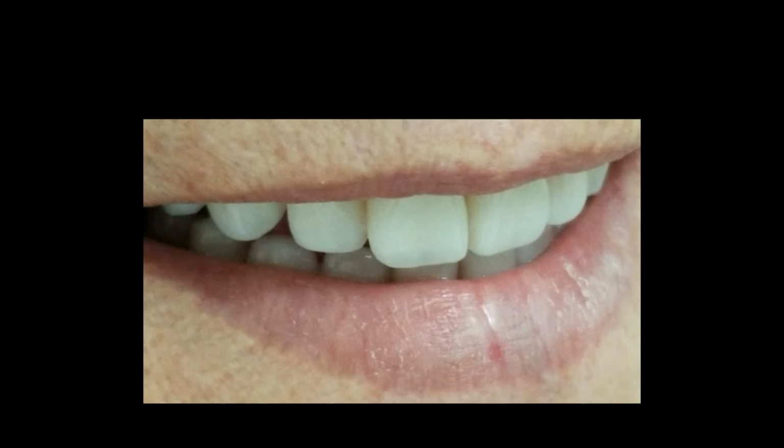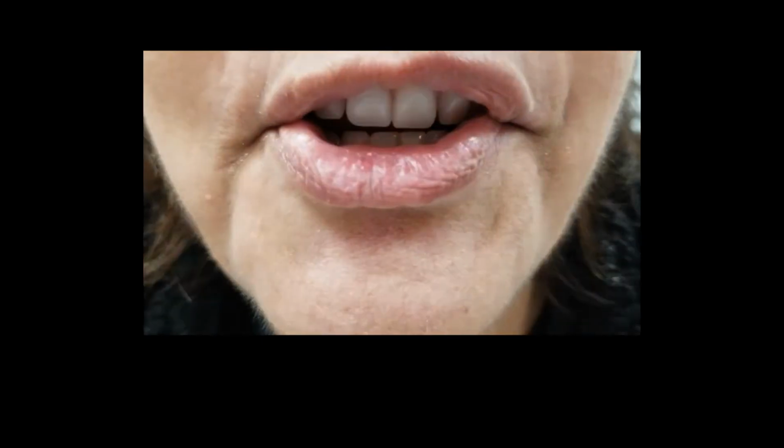So now I'm learning to identify a chew cycle of a patient. And even if you're a dental technician, this is something that you can take to your doctor, especially on the next stressful trouble case that you have come in and everyone's a little tense on it. You can say, look, I need you to take a video for me, and then we can have that conversation about what's a chew cycle and what am I going to need to do to make that correction. So take a look at this patient.